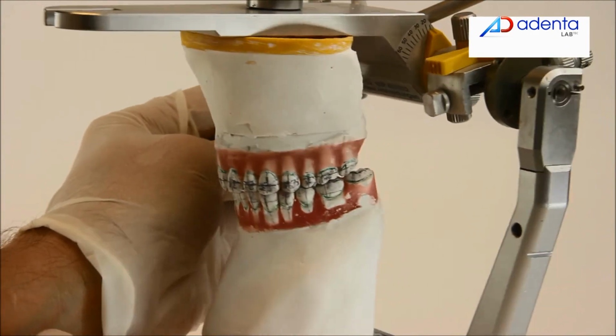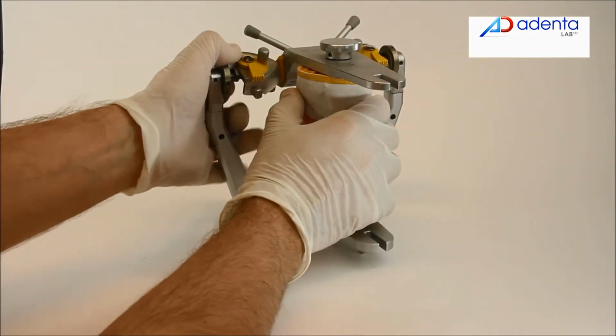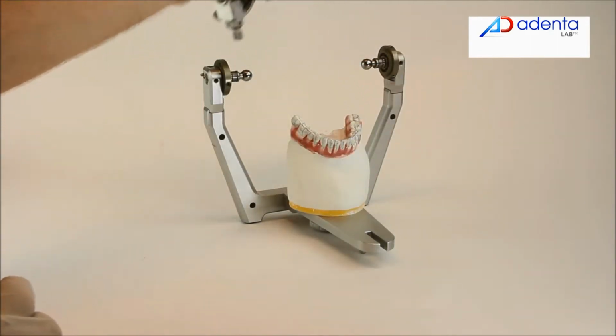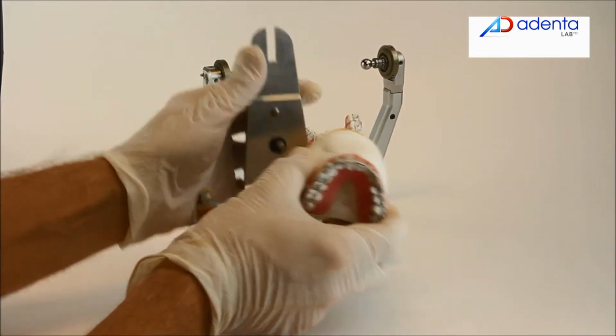The OPR allows also labial or lingual bracket positioning. First, place the corrected setup model into the OPR and use the indirect bonding plate in multidirectional adaptation appliance.